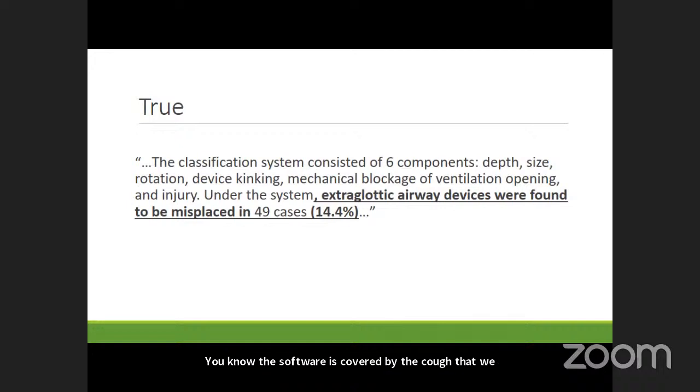As with any study, there are flaws. In this study in particular, they say they could have overestimated that 14%. There is a possibility some of these patients' supraglottic airways were moved or dislodged on the way to the coroner's office or the morgue, but there's no way we could know that. And even with those potentially displaced supraglottic airways, they were still likely providing oxygenation and some ventilation. Not the perfect amount, but even when inserted poorly, they still suspect it was working to some degree.